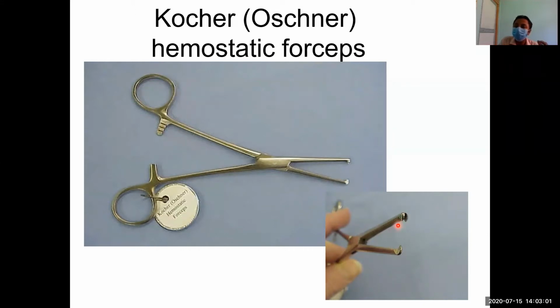Generally there are certain blood vessels while doing OT that, as we cut them, will go inside the tissue, or inside a tough structure, like an aponeurosis. So to hold those vessels that have a tendency to retract, we will use these instruments. Any artery or vessel that has a tendency to retract and go inside or under a structure, we will generally hold with this Kocher's hemostatic forceps.